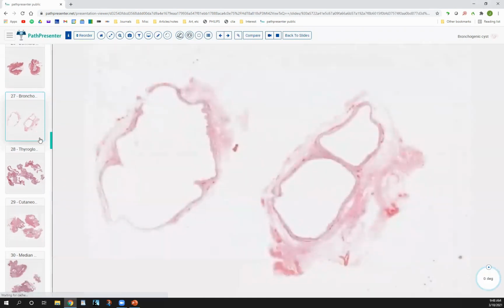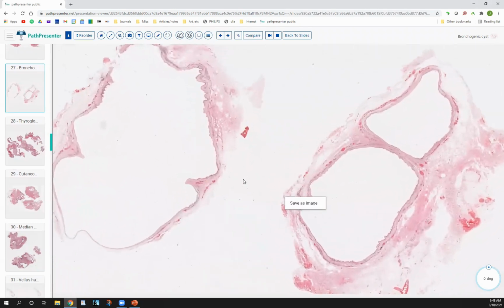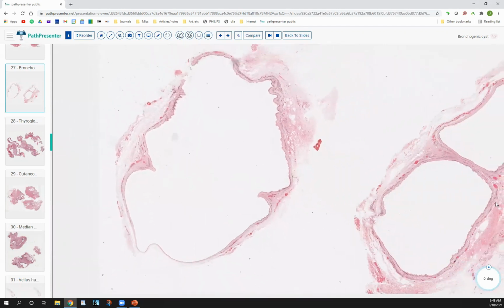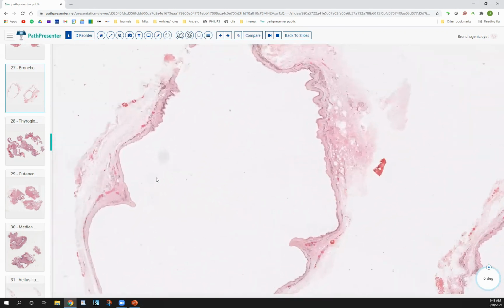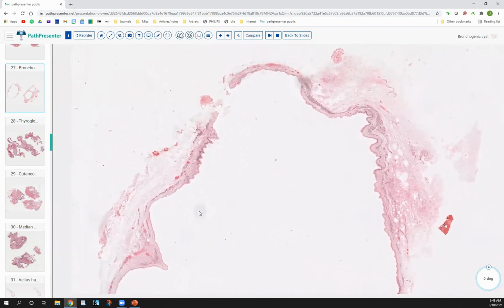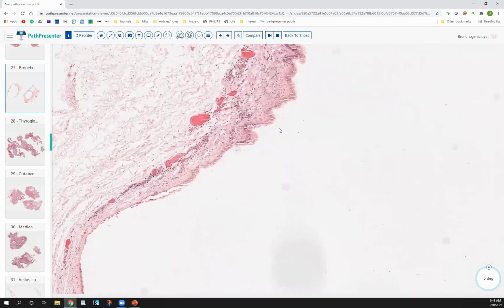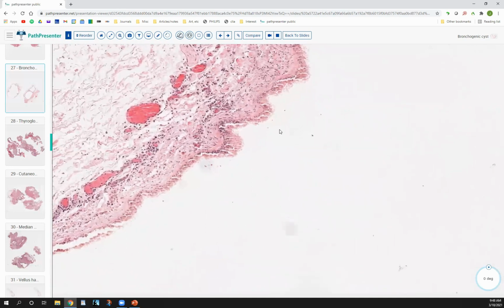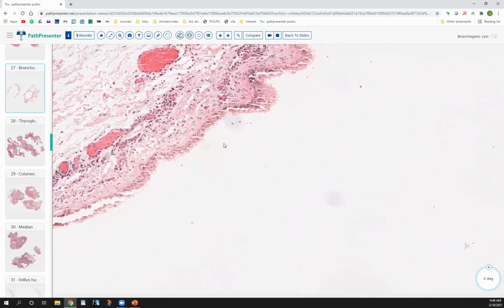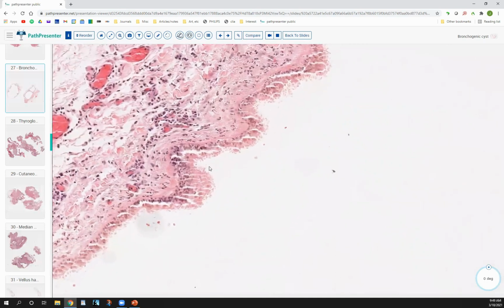Okay, so now we're going to move on into our really unusual cysts, the ones that maybe I've had one or two cases of, or maybe no cases, in my career. Again, same approach: no real contents to this one, and a very bland, thin lining here. It's hard to tell at this power what it is exactly, but if we go closer, we can start to see this is not squamous, so that's different. It's got a more cuboidal look, actually, or columnar cuboidal look to it. It's almost glandular, I would say. And even a hint, right here, of cilia.